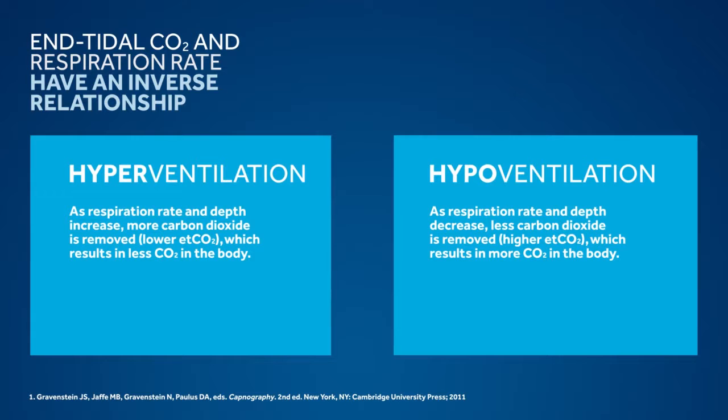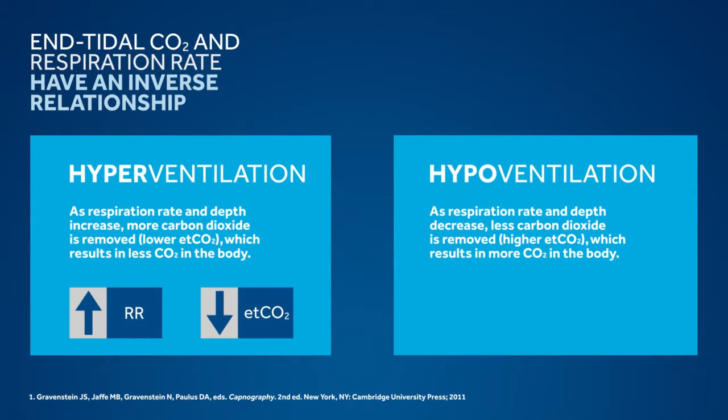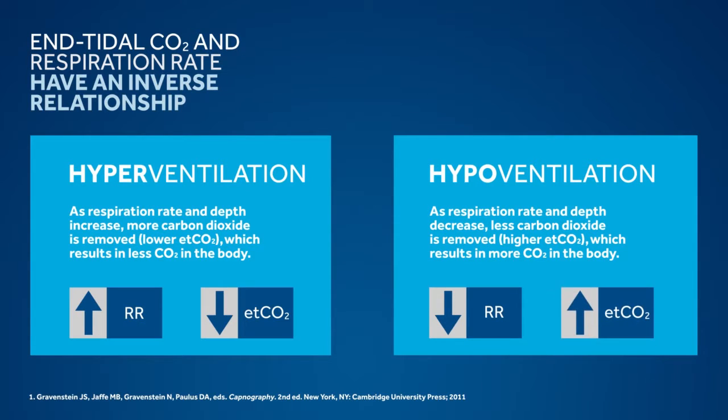In normal, healthy lungs, as the respiration rate and depth increase, more carbon dioxide is removed. This leads to a lower end-tidal CO2 value. As the respiration rate and depth decrease, less carbon dioxide is removed, resulting in a higher EtCO2 value.